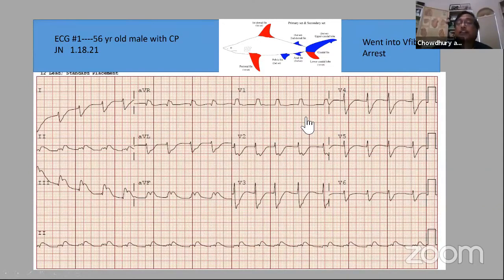Now, this is a patient, unfortunately, I'll show you this, of how the shark fin EKG is a problem. Came into the emergency room following VFib arrest, post VFib, the patient had this ST elevation in the inferior. And Rafique bhai, you may have a comment. We see this all the time. The bigger the ST elevation, the greater the chances of arrhythmia and poor prognosis. And I call it now, actually I did not call it, one of our techs pointed out, look at the shark fin. We talked about shark fin, but there is also the pectoral fin in the pectoral area. And this looks like a pectoral fin. The V3, V2 looks like a pectoral fin. Nobody has described that. Shark fin is described, but not the pectoral fin.